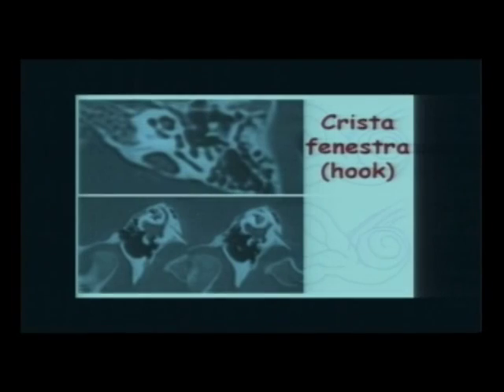When you remove it, you're going to see the carotid, you're going to see the jugular. Here you can see this is the stapedius, and this is the facial nerve. This is the malleus, this is the incus, this is the attic, this is the antrum. The lateral semicircular canal in the antrum, the bulge of the lateral canal. This is the whole mastoid. So it looks like the old mastoid x-rays, but it's more refined and appears more nicely.